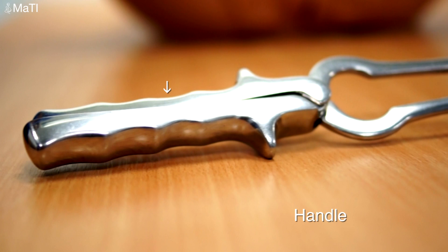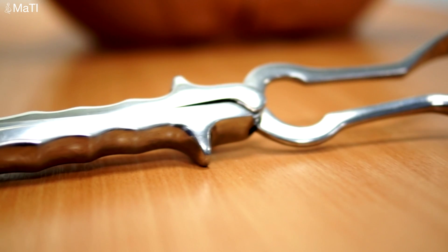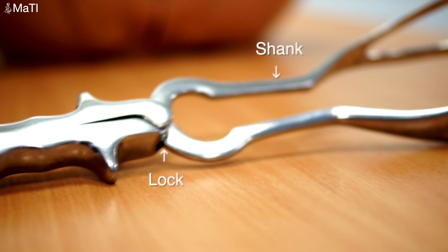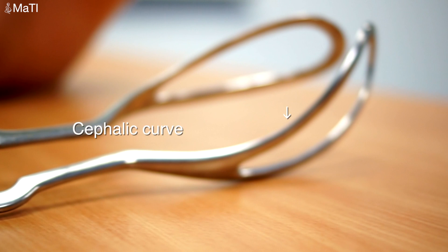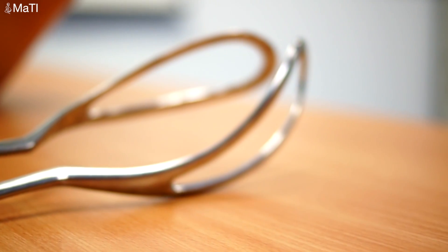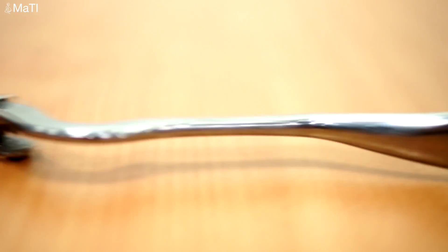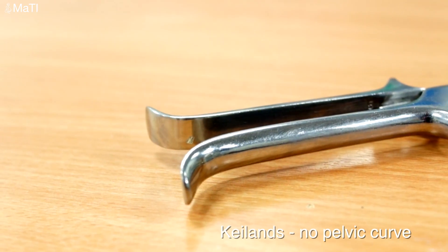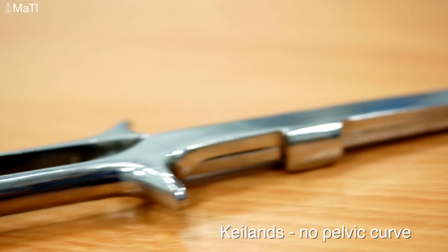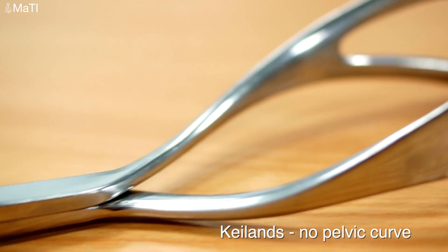These are a pair of long-traction forceps. This is the handle. Here we demonstrate the lock and the shank. Here we demonstrate the cephalic curve, which follows the curvature of the fetal head. This is the pelvic curve, which follows the curvature of the maternal pelvis. This is a Chelens forcep used for rotation — it has no pelvic curve.